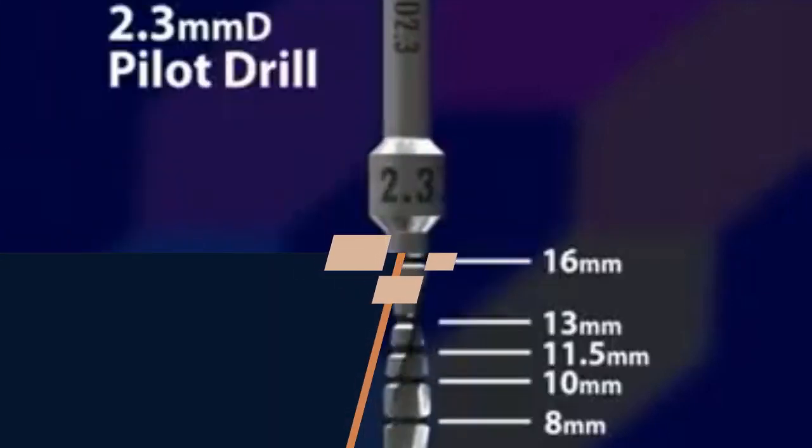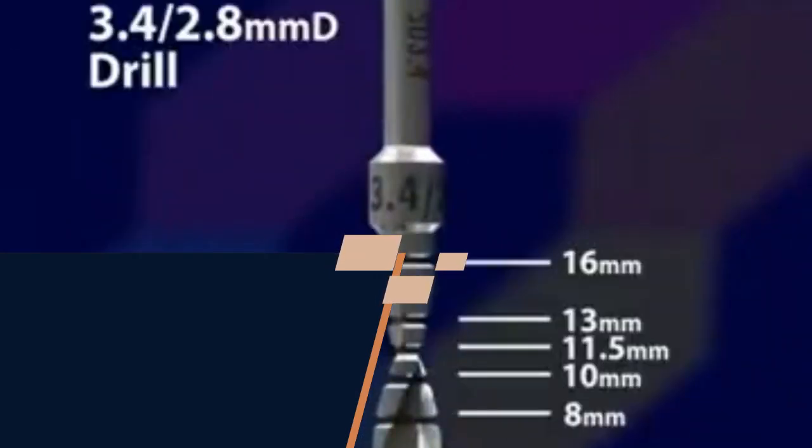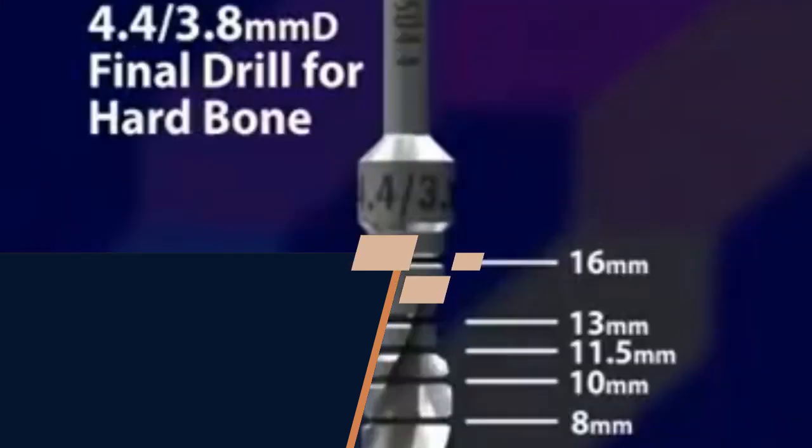Dental implantation is a surgical procedure used to replace missing teeth with artificial tooth roots made of biocompatible materials, usually titanium or titanium alloys. It is considered one of the most effective and long-lasting solutions for restoring the functionality and aesthetics of a person's smile.